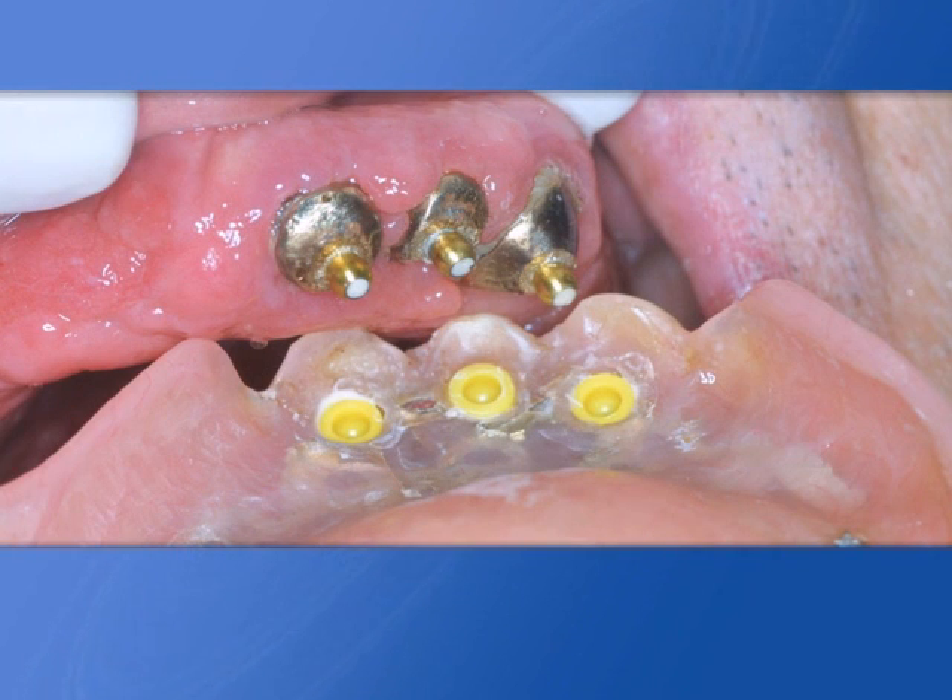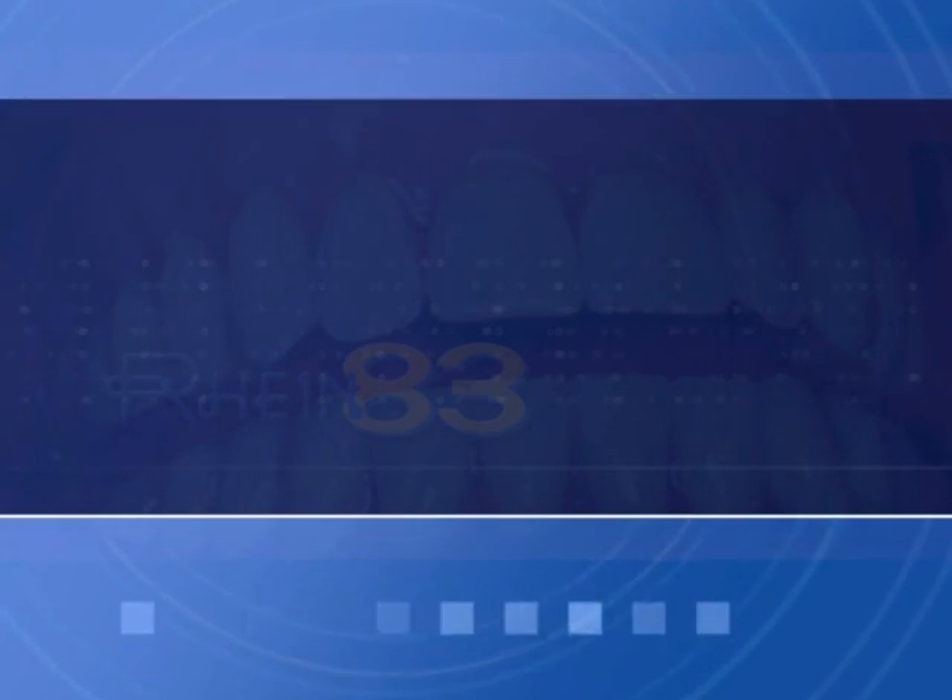Reconstructive sphere in optimal position. Second case.